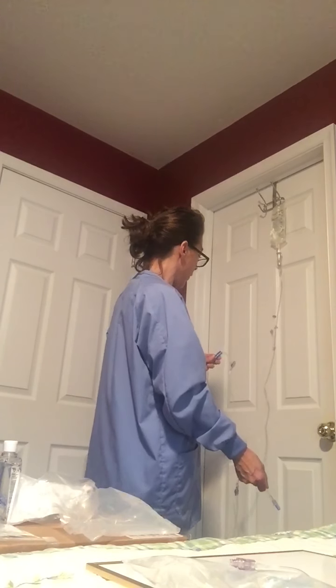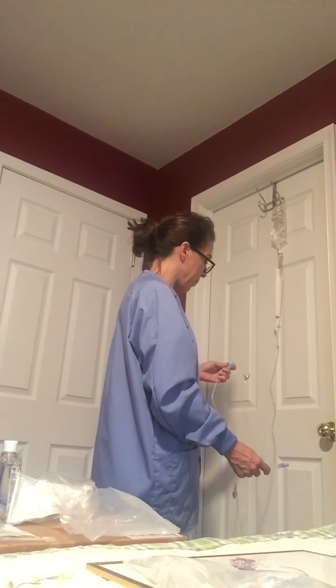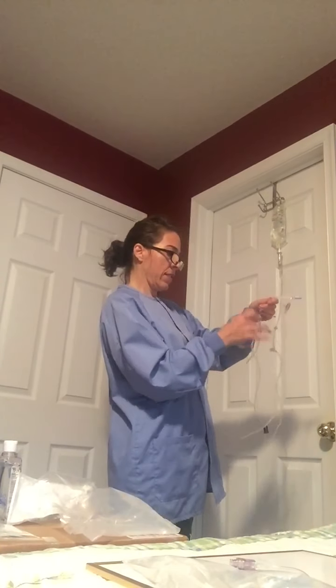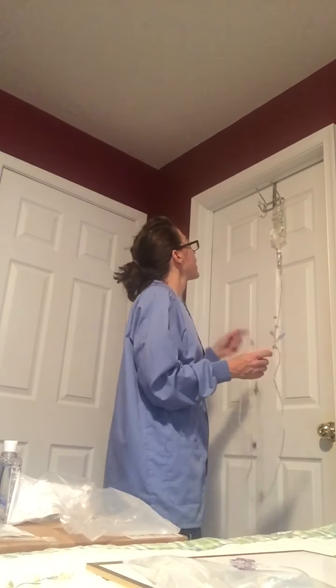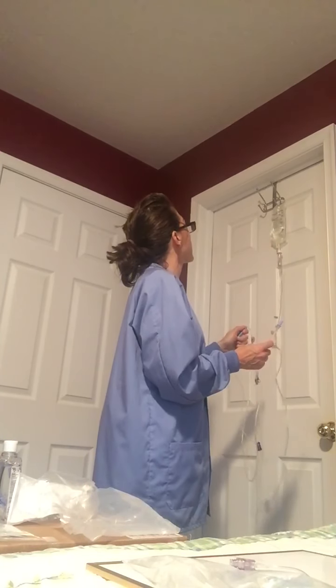Okay, so I have my tube primed, and I have a bowl down here catching the fluid. So I'm going to close my roller clip, but if there were air in this line, I could maybe flick it and work the air out of the line. Now I'm going to set my drip, and we'll say this is 20 drips per minute. So for 15 seconds, I could watch for 5 drops to fall, and that would give me 20 drips per minute. So let me set this.